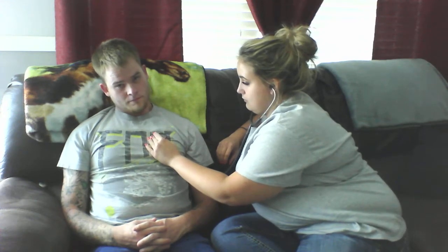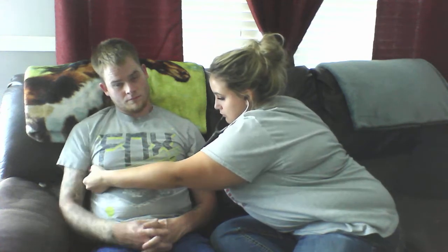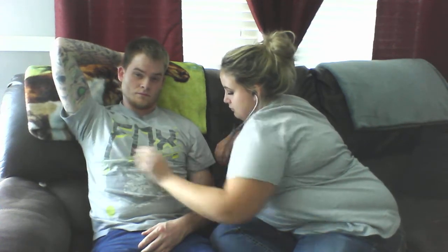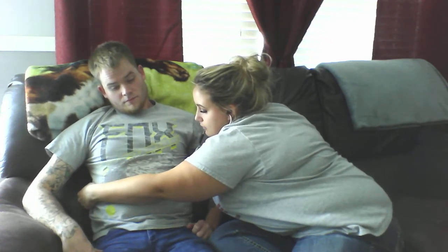So from there, we can go ahead and listen to lung sounds. Deep breath in and out. Okay, and I did not hear any adventitious lung sounds, no crackles, no rales, no rhonchi, anything like that, so that was a good finding. If I did hear those, then obviously we'd have lung issues. So from there, I can have him turn to the side for me, because I'm going to listen to your back.